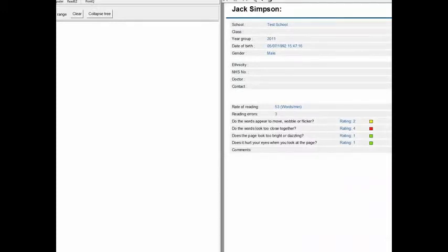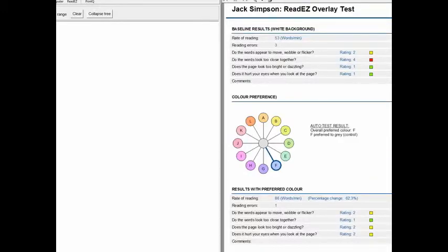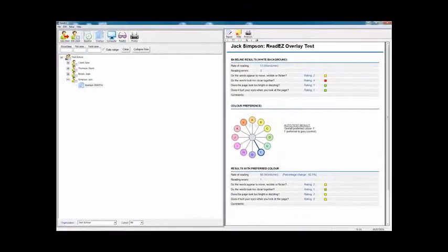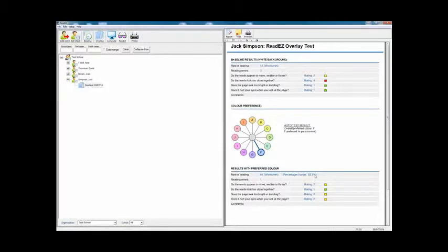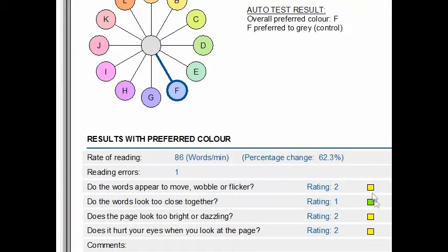Under Jack Simpson, it's now got the overlay test and the date it was performed on. When I click on that, you can see that the color preference is shown — ReadEasy color F was the overall preferred color, and F was preferred to the gray control. At a glance, the rate of reading was 53 against the white background — that was your baseline with three errors — and that's improved to 86 with one error. That's a 62.3% improvement in the rate of reading. You can also see at a glance that the symptoms have been ameliorated — lessened by the use of color.